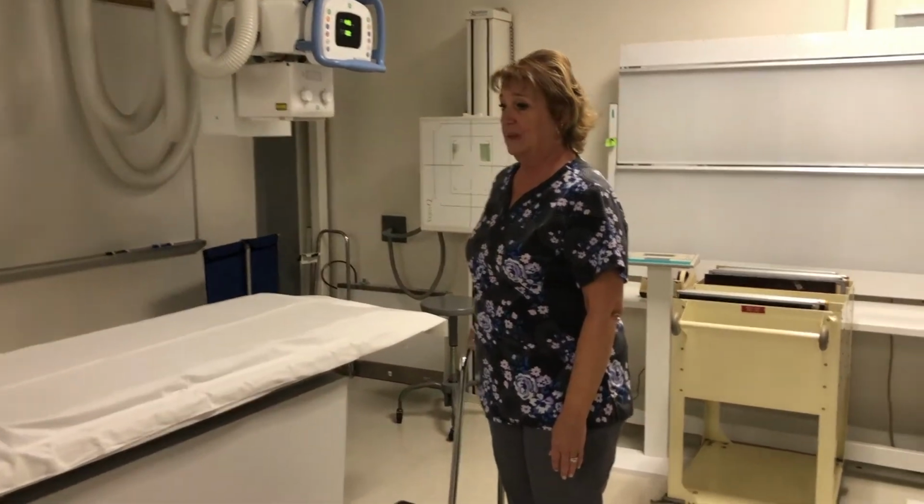Demonstration is going to be of the lumbar spine. Depending on your clinical site and the protocol, you will either be doing a 2-view, a 3-view, or a 5-view lumbar spine. I'll be demonstrating all 5 views and the way the textbook recommends that you do this. There may be some variances at your clinical site, but the text you work with will show you that.